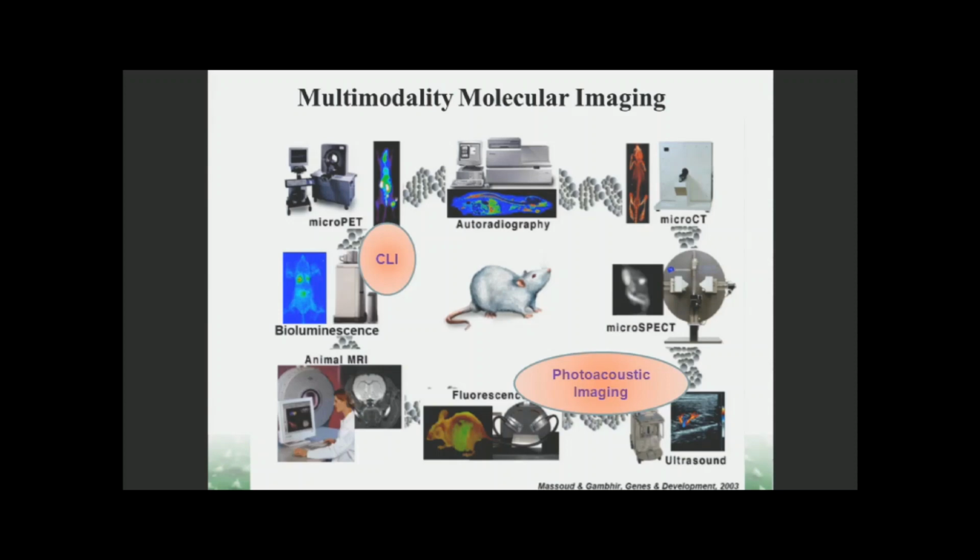So basically you use a radionuclide, usually one that's used for nuclear imaging, and then you also use an optical imaging instrument to capture the signal and to obtain an image. So basically, you bridge nuclear imaging and optical imaging, and come out with this new kind of imaging technology, named Cerenkov Luminescence Imaging.